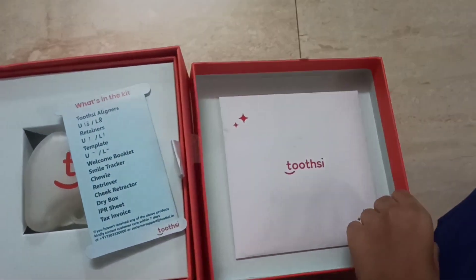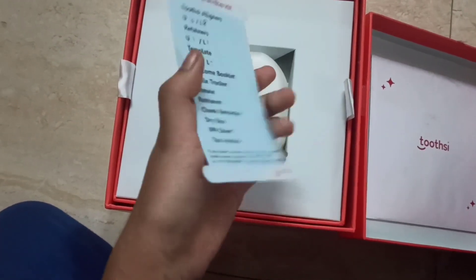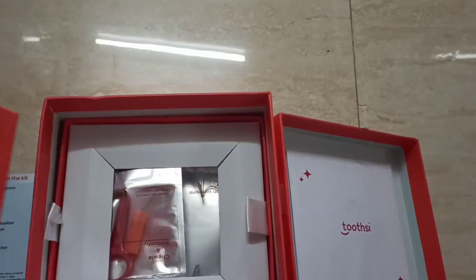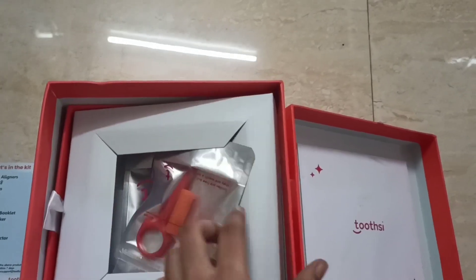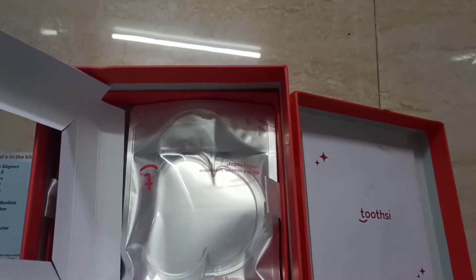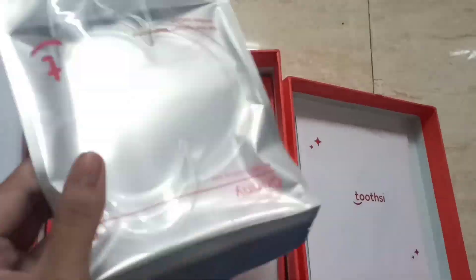So this is the box given by Toothsi. This paper contains all the list of items which are in the box, including my list of aligners. This is the small box which helps us to keep our aligners safe when we remove them. So this is a Chewy and a Smoothie - I am going to tell you their use in the further video so that you understand it more nicely.